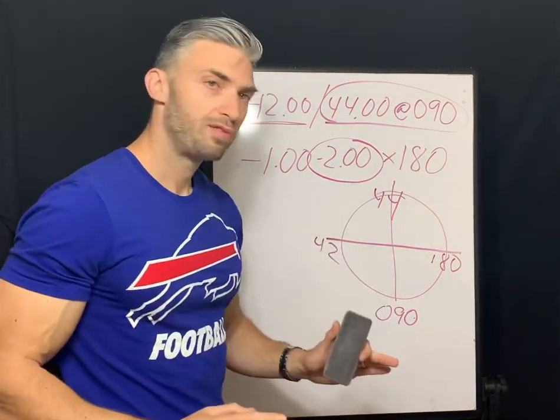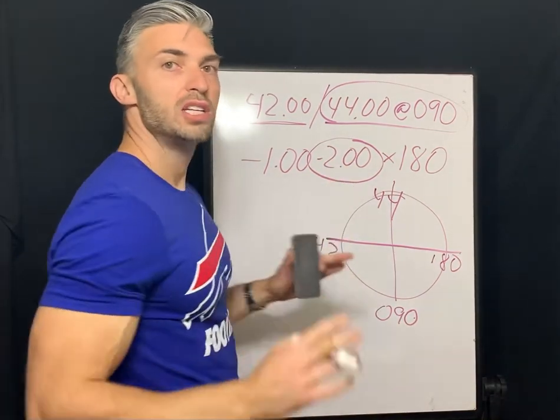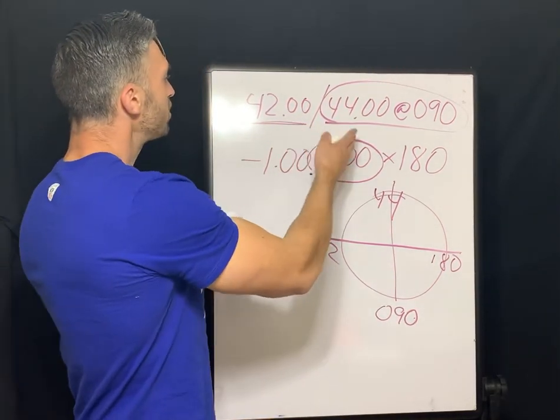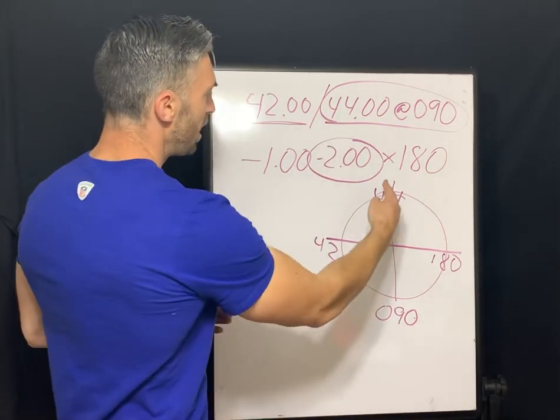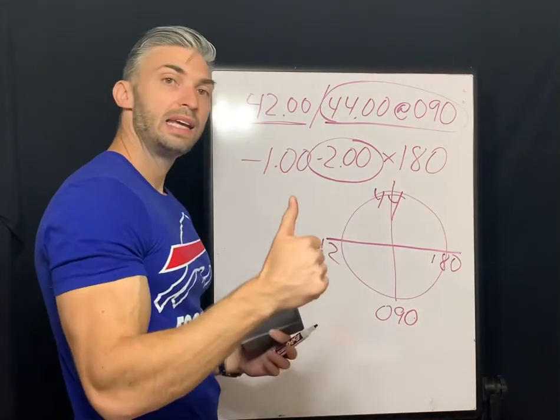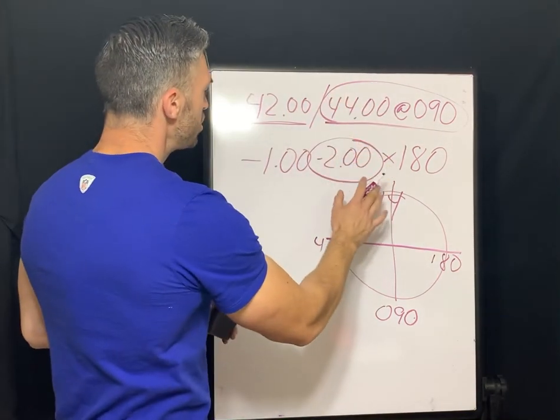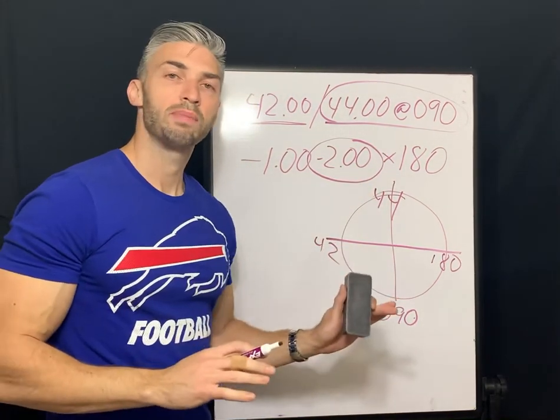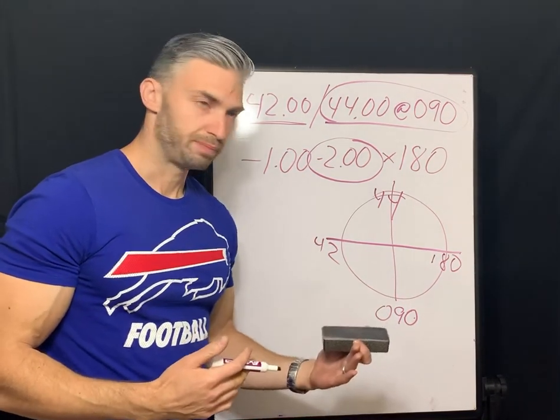What we need to look for is, does the cylinder power of the refraction match the cylinder present in the K readings? The cylinder is the difference between the K readings, from the steepest meridian to the flattest meridian. This is our steepest power, this is our flattest. Is that 2 diopters of difference? It is. So our corneal astigmatism from our K readings matches our refractive prescription, our 2 diopters. What we can deduce from this is that all of this patient's astigmatism is corneal astigmatism.